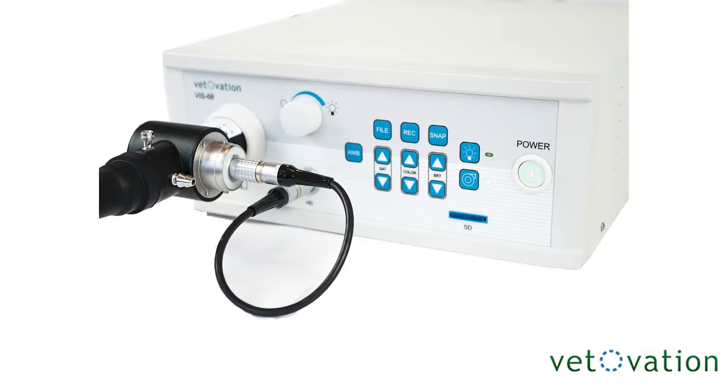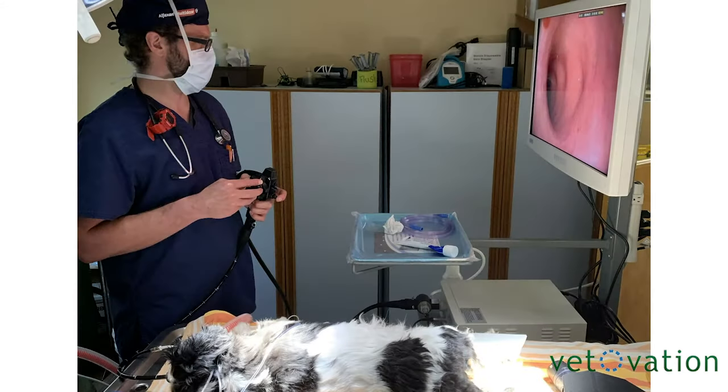The Vetovation endoscopy system enables the use of both flexible and rigid scopes for diagnostic and therapeutic solutions in your practice.